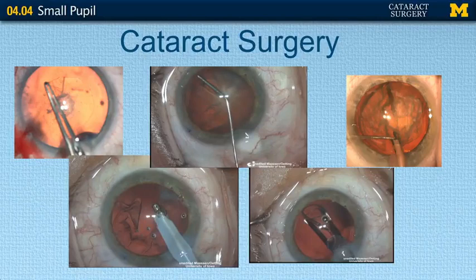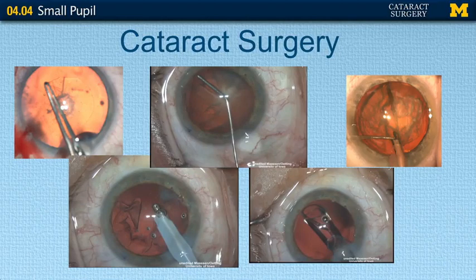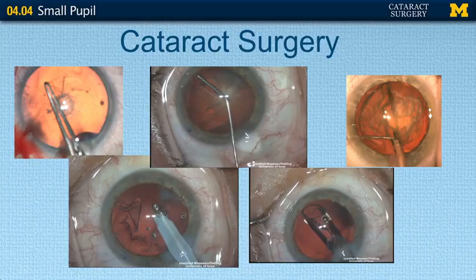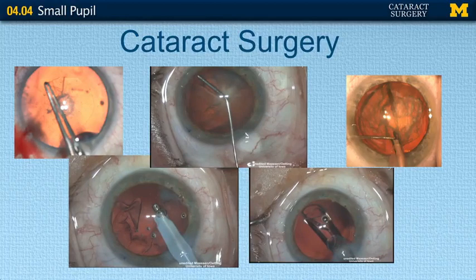A small pupil affects various stages of cataract surgery. The first step it affects would be your capsulorhexis. We often use the size of the pupil as a guide to constructing the capsulorhexis, so if you have a small pupil the capsulorhexis tends to be very small, which can lead to difficulties in irrigation and aspiration when trying to remove the sub-incisional cortical material. The other step it can affect would be hydrodissection — with a small pupil, seeing the fluid wave becomes more difficult. Phacoemulsification can also be affected as far as being able to see the nuclear fragments to remove them.